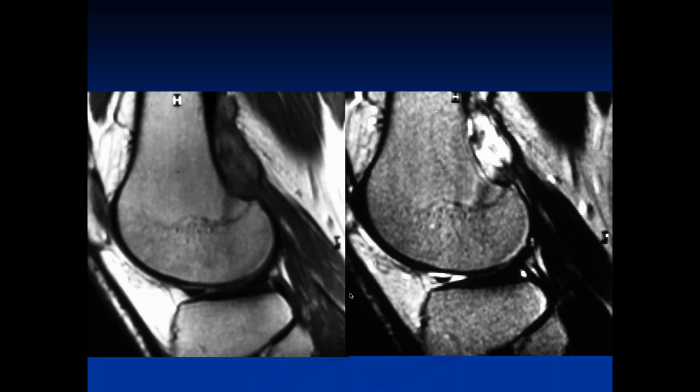So, two images of the knee, T1 and T2. There's a high signal intensity lesion on T2 and low signal isointense on T1 at the tendon insertion of probably the gluteus medius. No, I'm sorry, it's lateral. So, gluteus lateral belly of the, not the gluteus, gastrocnemius. Gastrocnemius. Sorry about that.